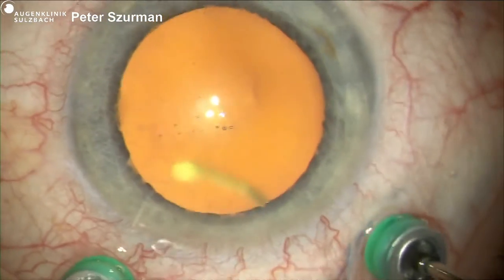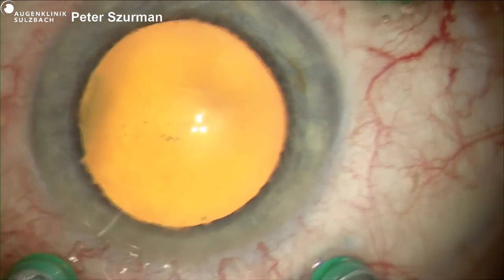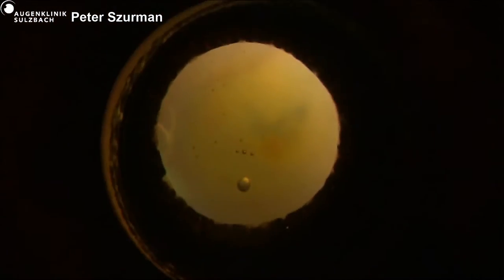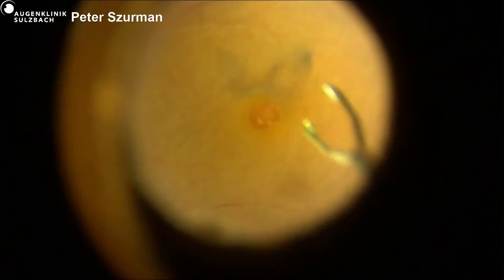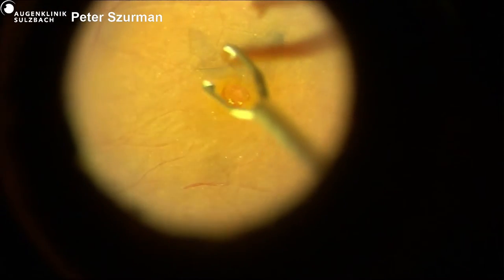I performed the core vitrectomy, and then I put triamcinolone to highlight the posterior hyaloid, and I removed the posterior hyaloid from the optic nerve to the temporal side in a centripetal way to trim the hyaloid, and then I introduced a double blue dye to remove the ILM.